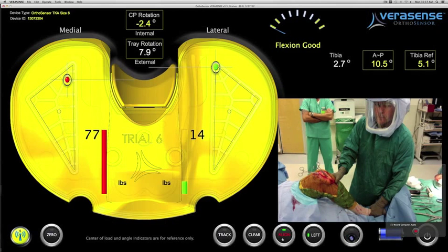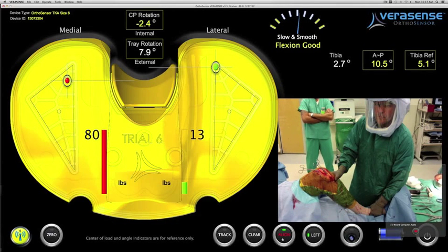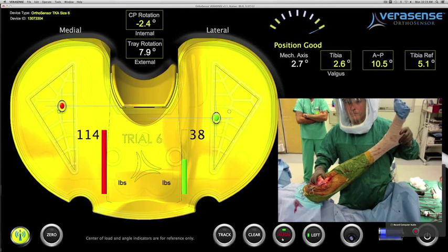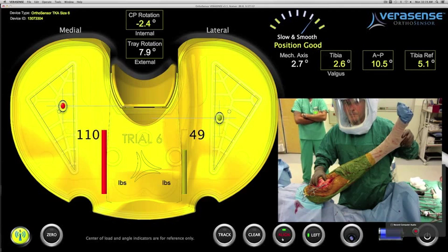The first step is to detect any malalignment on his tibial cut. By pivoting the leg off the heel, the accelerometer in the upper right-hand corner is telling him his tibial cut is in 2.6 degrees of valgus, which could be adding to the overall medial soft tissue tension.